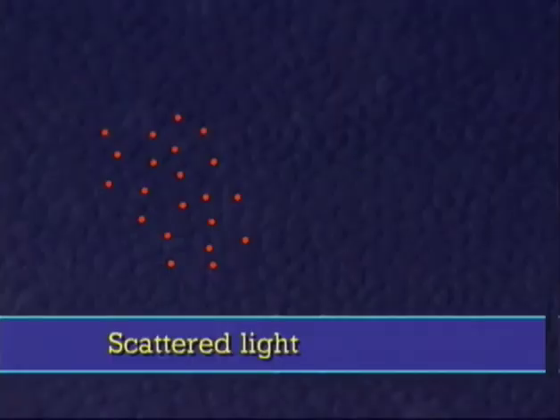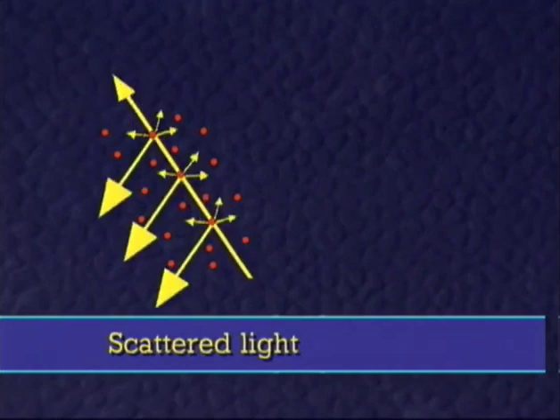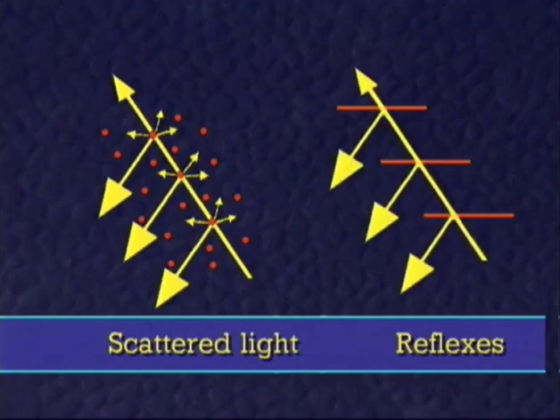If the tissue not only consists of a homogeneous distribution of molecules which causes light scattering, but also contains a non-homogeneous distribution with internal surfaces causing reflexes, scattered light and reflexes occur simultaneously within the same field. For example, in this lens with congenital cataract, one can see zones of increased brightness. One zone of brightness is due to an increased scattering of light, indicating a pathological process. Another zone indicates just internal reflections in a normal lens cortex. How can we distinguish between the two phenomena?